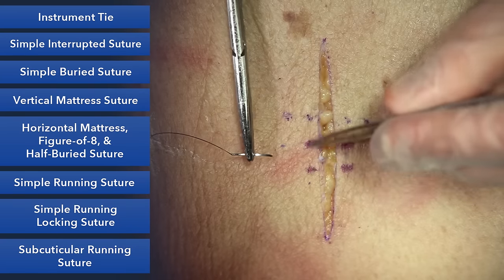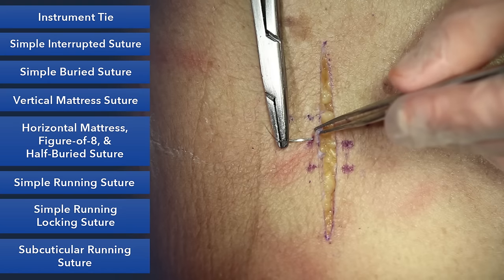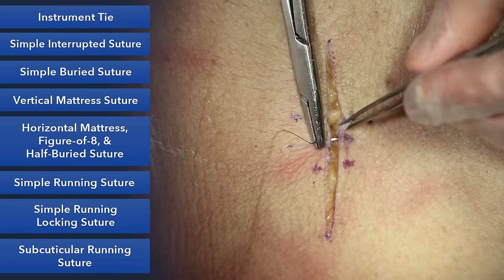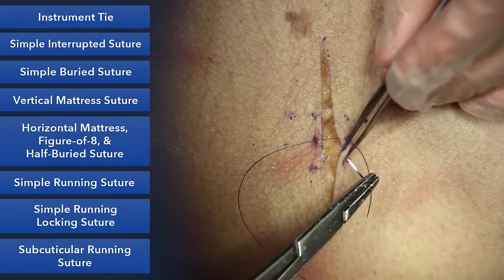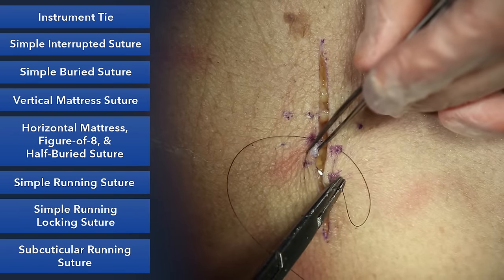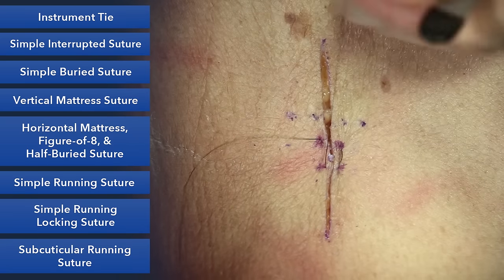It's important here that you stay close to the skin edge and that you're the same distance on both sides. You'll take your bite on one side and then the other side. And then you'll turn it around and you'll go back so you end up on the same side. And there you can see our mattress.